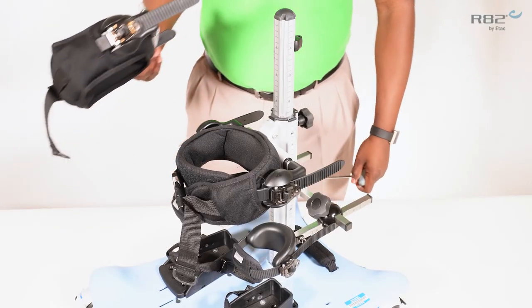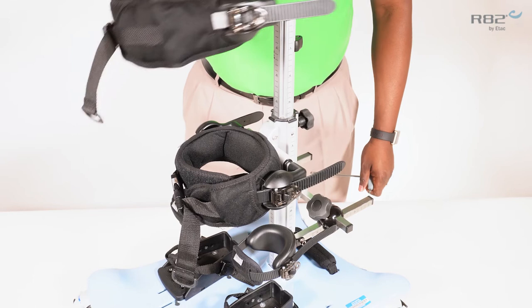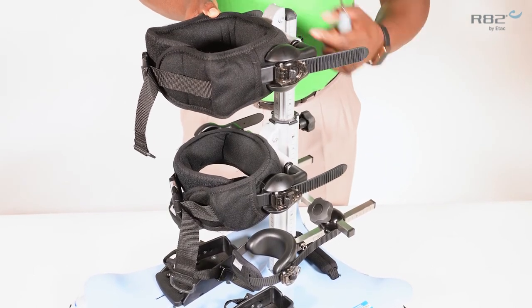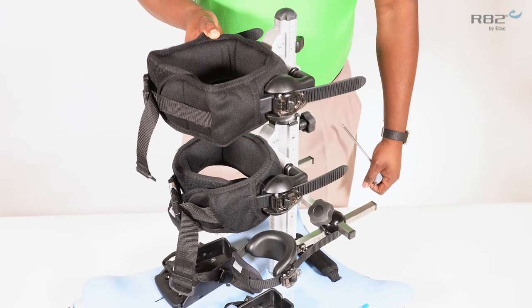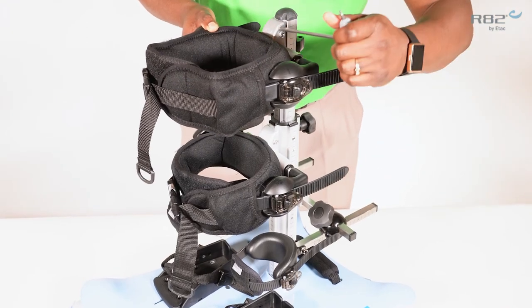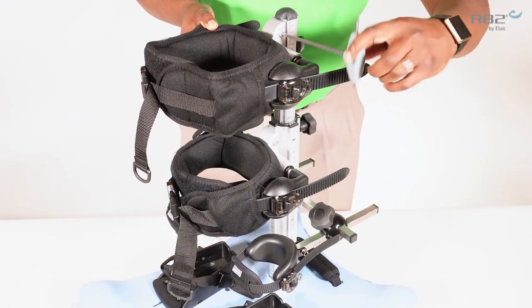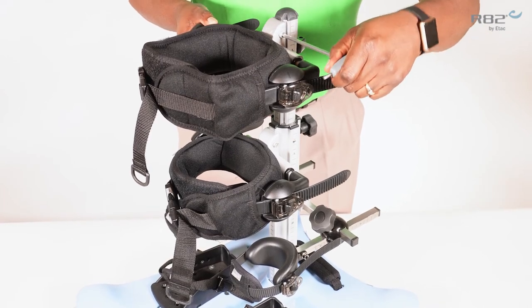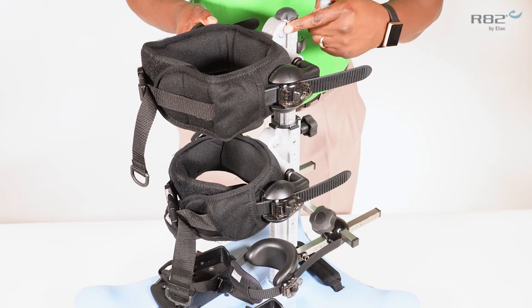The trunk support will attach in the same manner by loosening your universal mounting bracket, aligning it with the column, and once you reach your desired height, tighten the bracket onto the column.